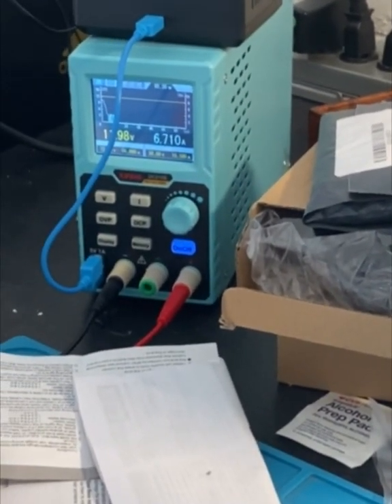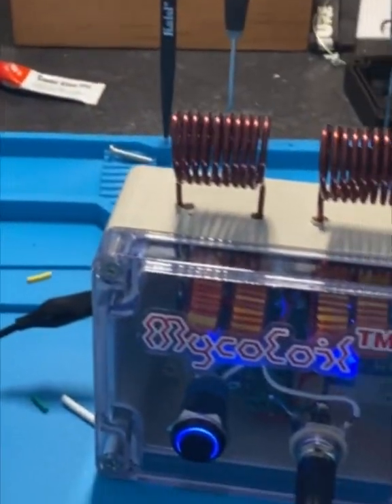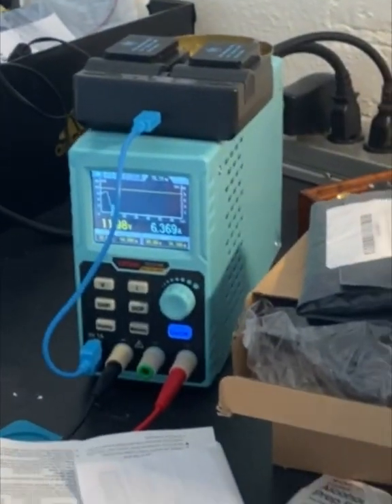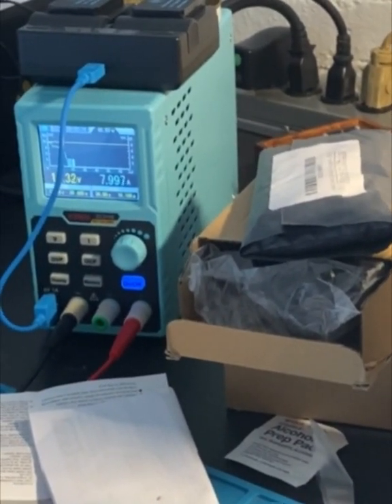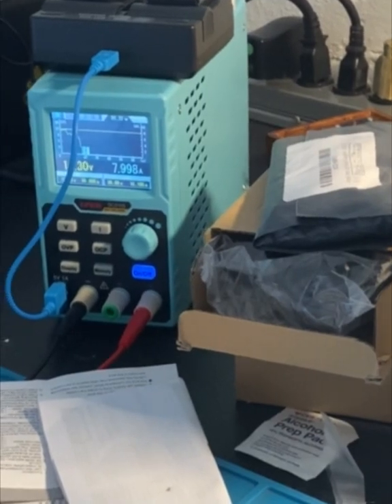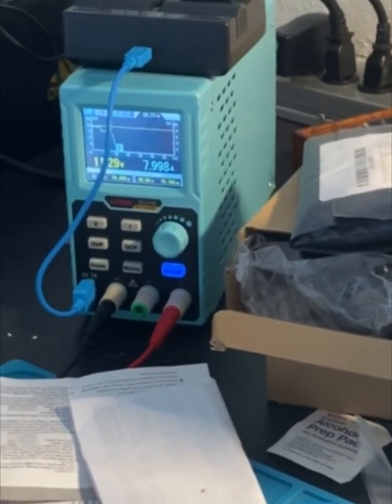Inside one coil it's pulling 0.6 amps. If I insert it into the other coil it's 0.8 amps — that's excellent.